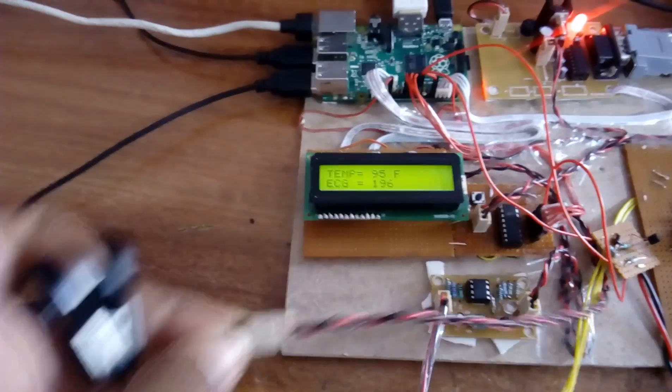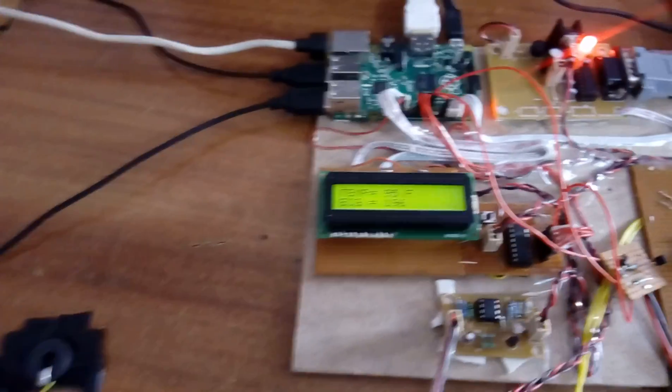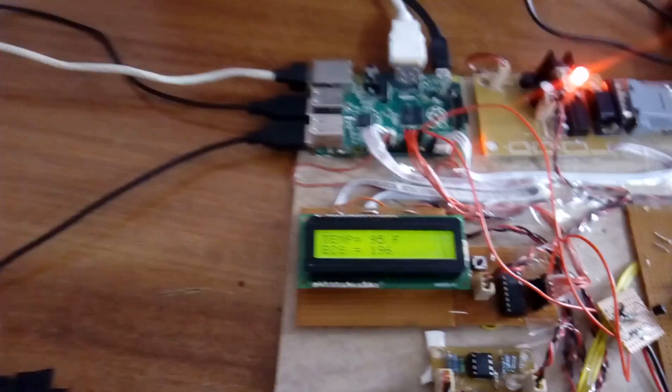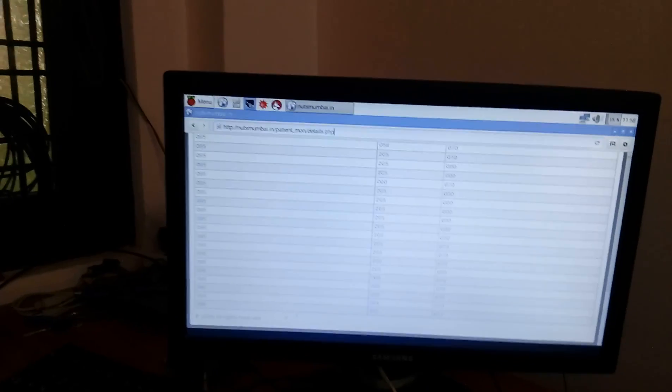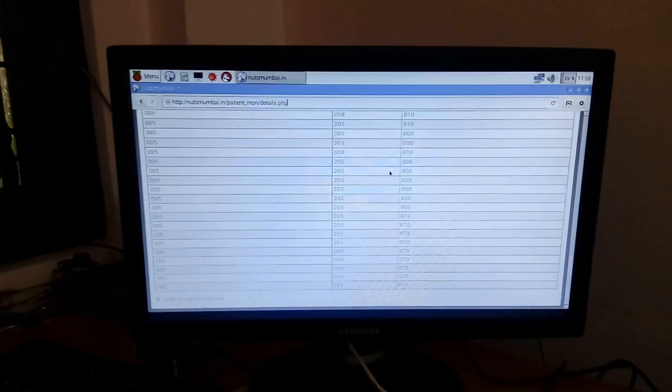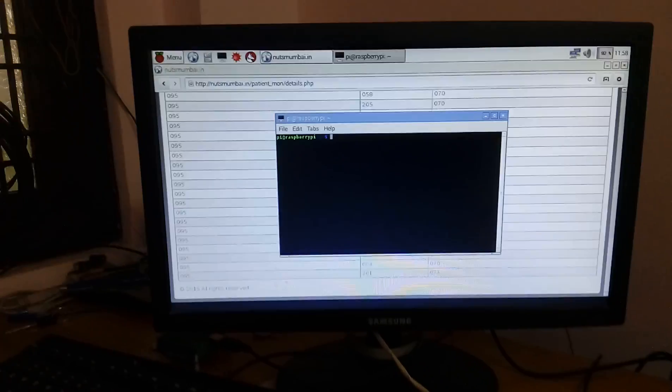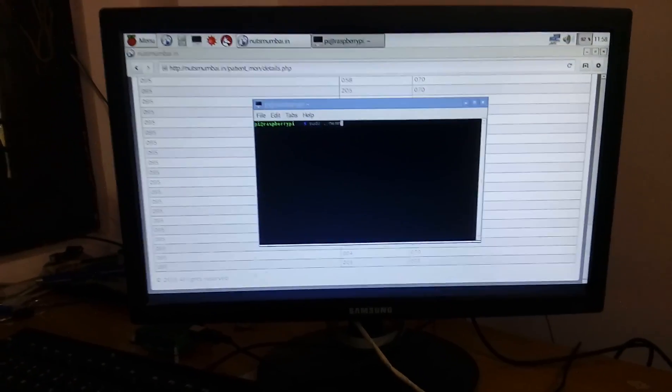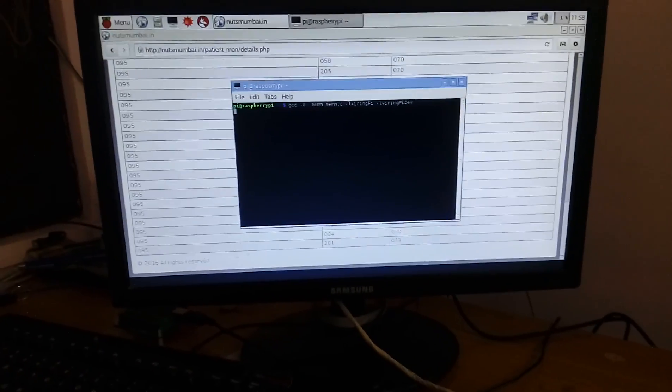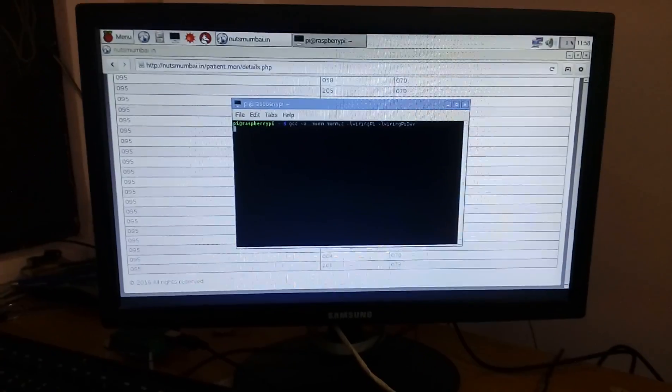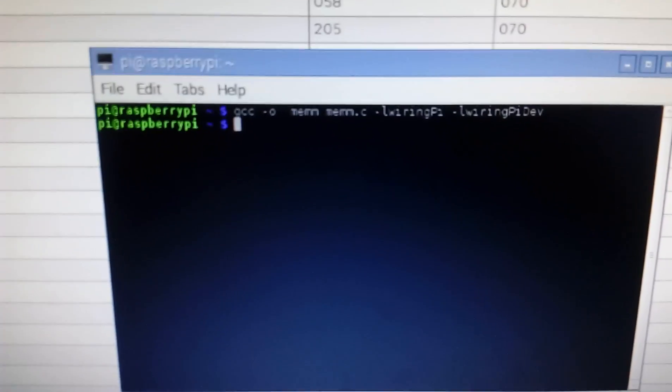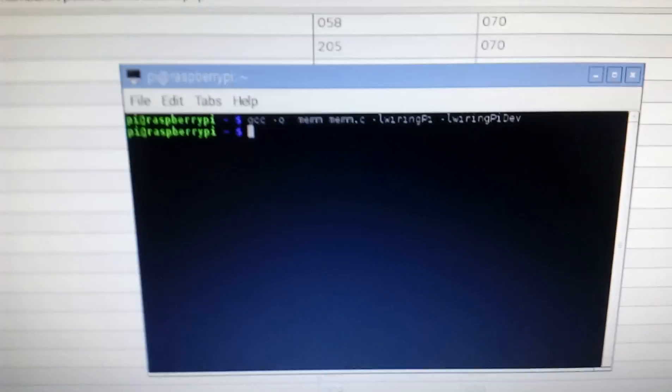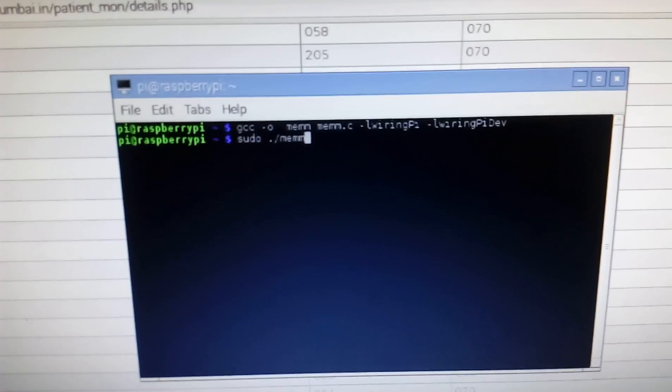Put the LM35 temperature sensor in your hand. It will take the data. Keep the ECG probes, so all the data will be updated. You can execute gcc -o and run it.